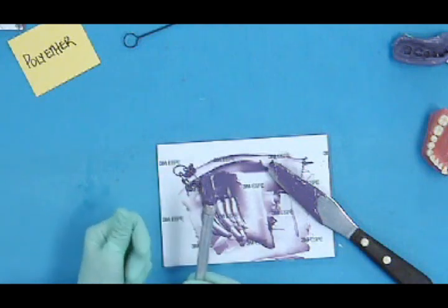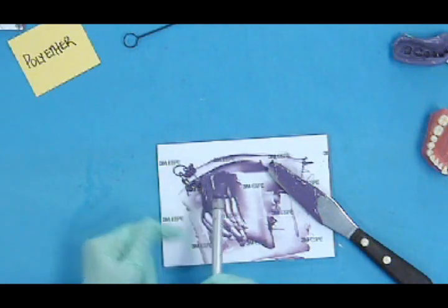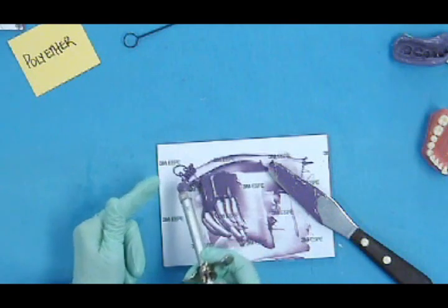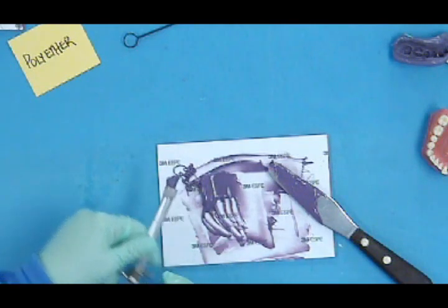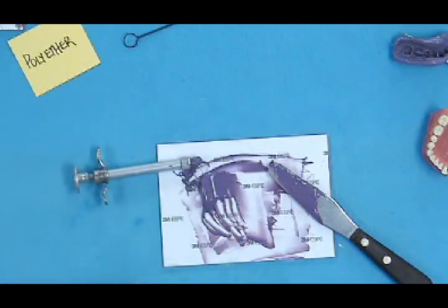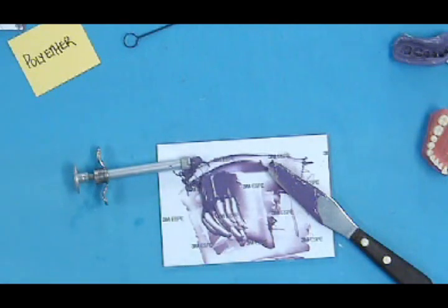We seem to have a malfunction here. It may be the tip that's got a crack in it. But we could still get it around the tooth, but you can see that there's a lot of excess there. The challenge with these syringes is cleaning them, obviously. Again, you're going to leave it until the material is set, until it reaches its final set.